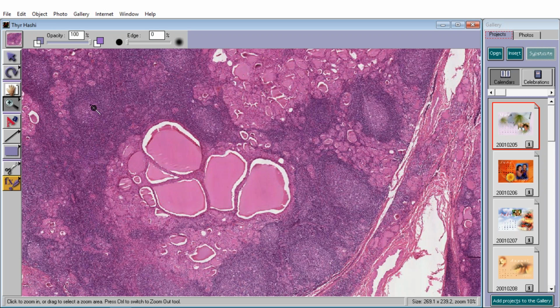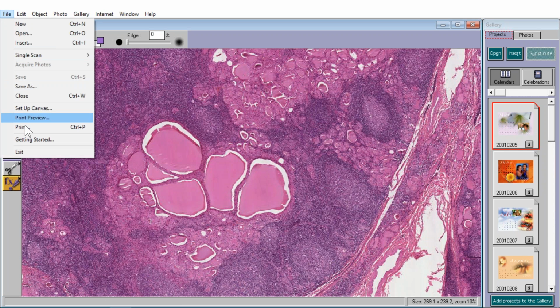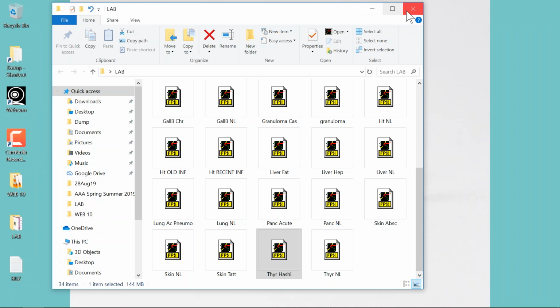Well, you have to see lymphoid follicles within or surrounding thyroid follicles. Just like with the adrenal gland. Remember, we said that the adrenal gland was lymphocytes attacking the adrenal cortex, so you could call that autoimmune adrenalitis, but you could also call it Addison's disease. So the same thing with the thyroid. You could call this autoimmune thyroiditis, or honor Dr. Hashimoto and call it Hashimoto thyroiditis.